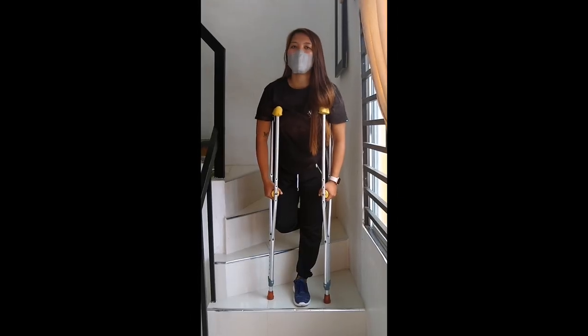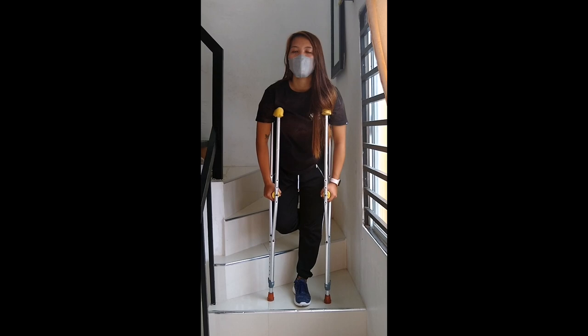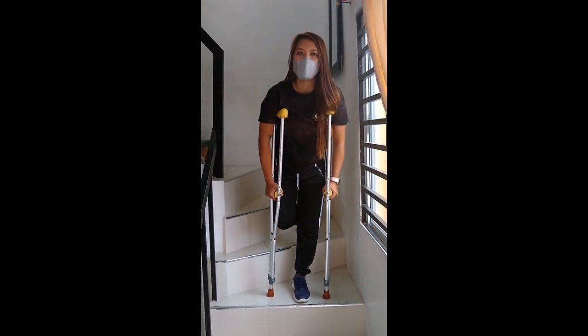Ang susunod na step ay yung pag-baba ng sampa. Bauna po yung crutches. Sumunod po yung bad leg nyo. Ang sumunod po yung good leg.